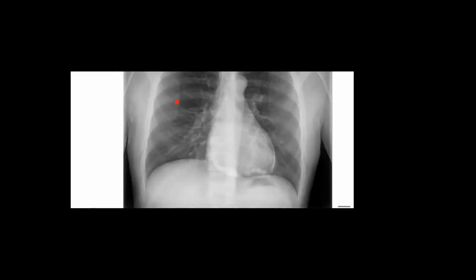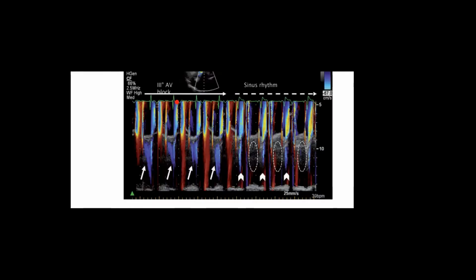Now, what do you see here? Sorry. Yeah. You want me to go back? I didn't see the ECG. Yeah. What we said here is we have this arrow. This part. Sorry. This one here is diastolic MR. Let's time it.